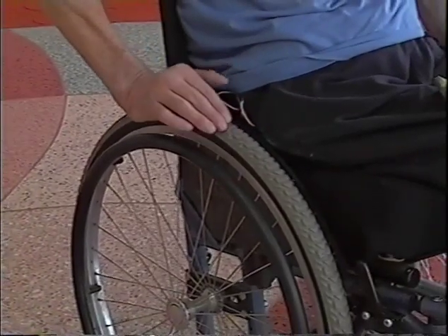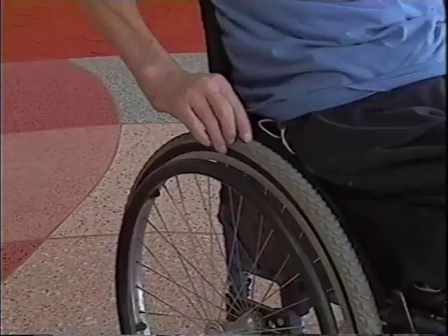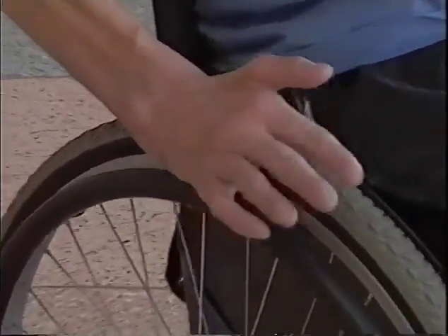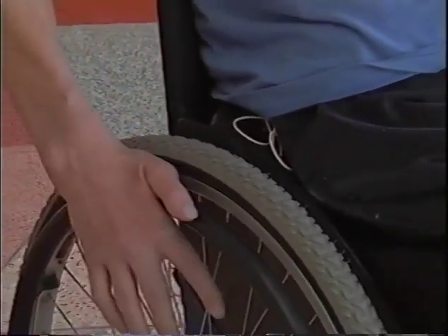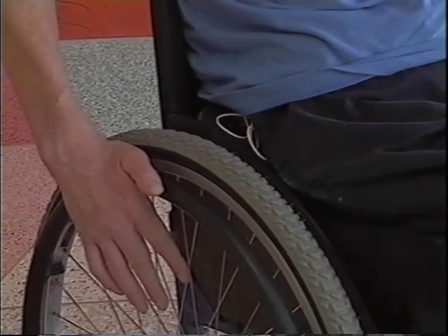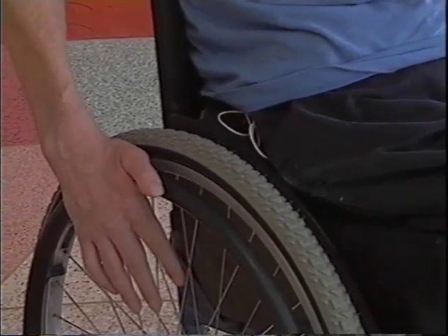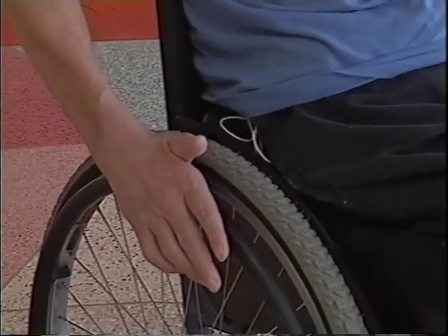So it gives you a little more leverage, it's higher, and this dimpled effect really gives you a lot of traction.